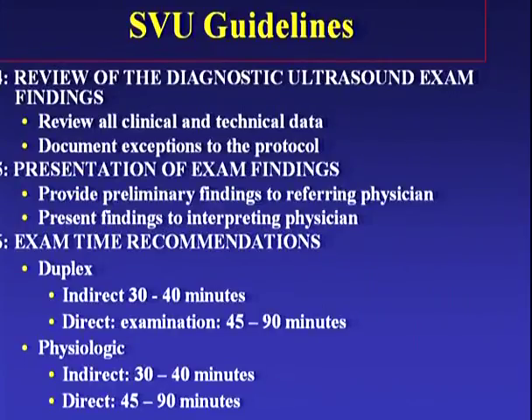After that, you want to review the diagnostic ultrasound exam findings. You want to present these exam findings to the interpreting physician so he can then extend the final report to the requesting physician, and with that, you should have a complete exam.